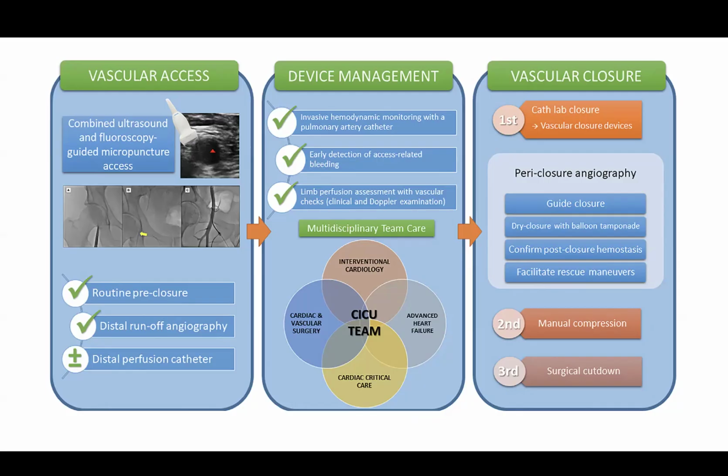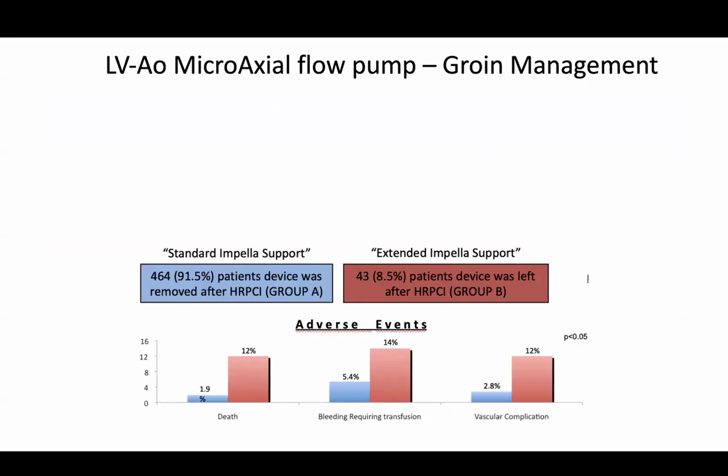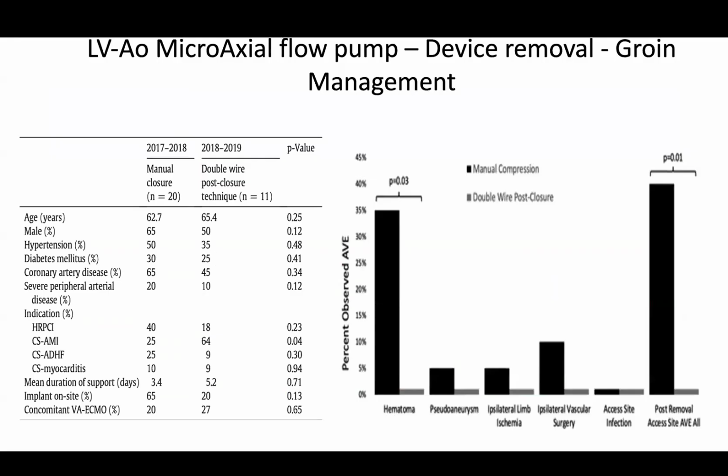Again, this is all research, but the problem with the Impella sheath is it doesn't provide enough flow through that side port to perfuse the leg. So some of the places are doing fem donor to recipient, a bigger sheath on the left, and then your 6 French in the SFA on the right. But I think at the beginning, what we should try to do is, let me see here.